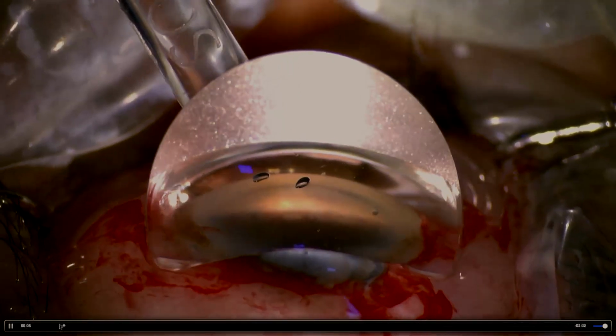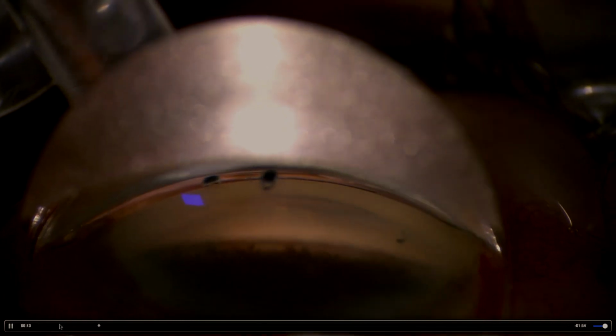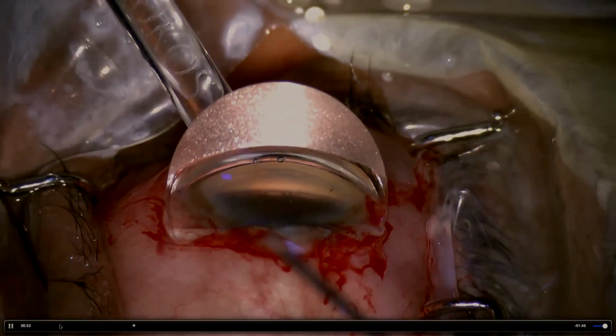So the key points here are your left hand and your left leg. Now I am zooming in with my left leg, and I am now fine focusing again with my left leg. So now I am doing the fine focusing. This is a 2-minute procedure once you master it. You can see the length of the video is 2 minutes. I have not edited it, I have not fast forwarded it. Now I am zooming out.